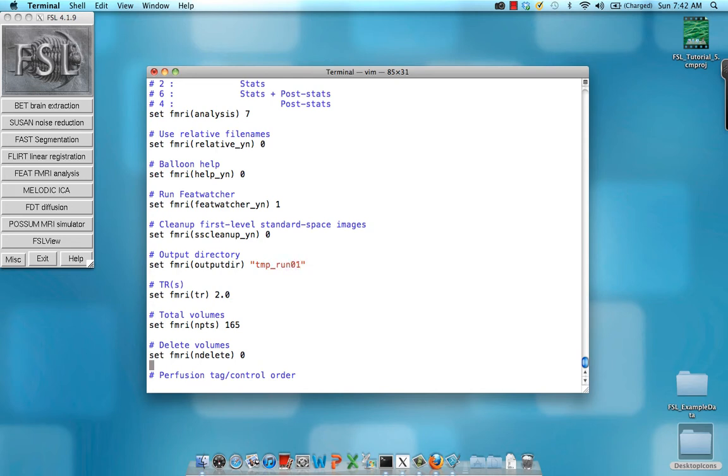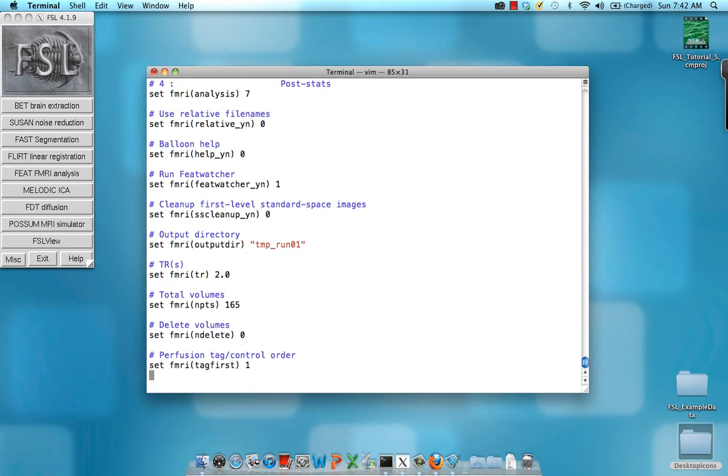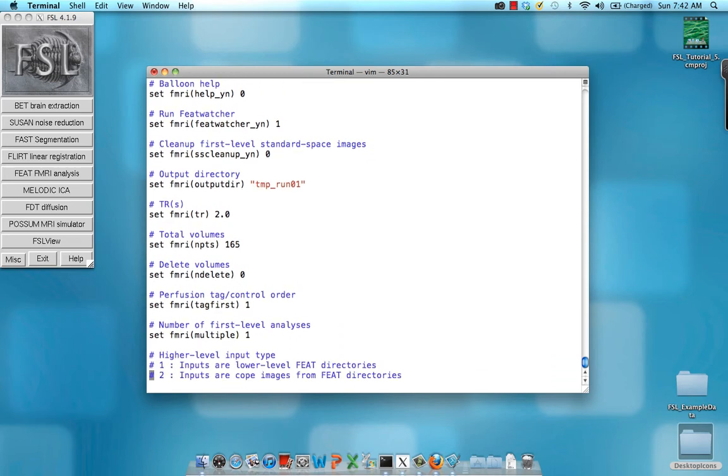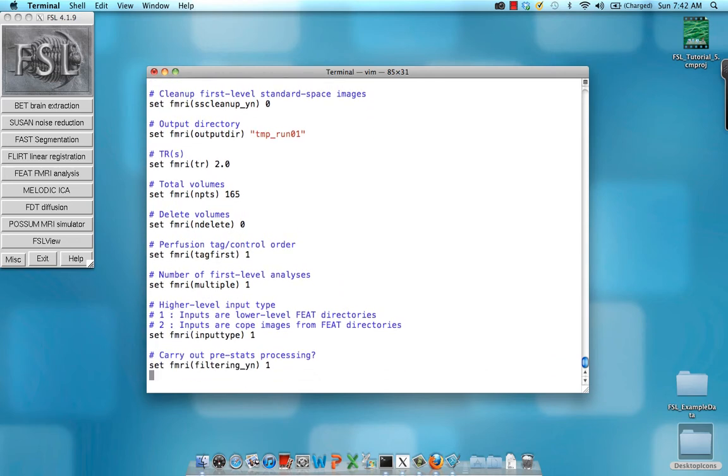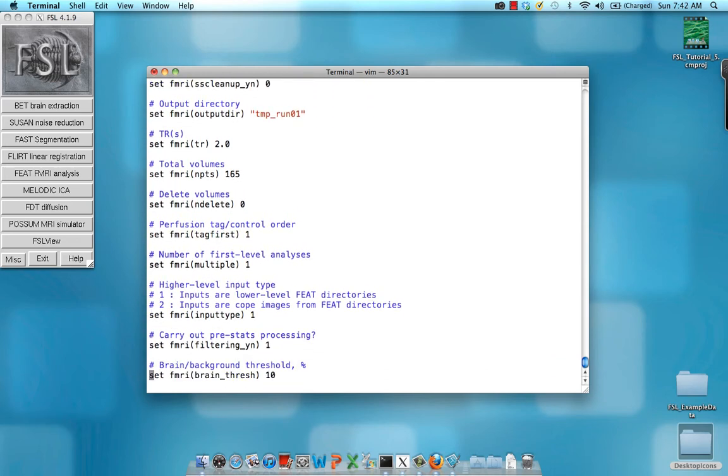So now when I run this, there will be a new directory within this temporary folder called temp underscore run 01, which will do the same analysis that was done before.